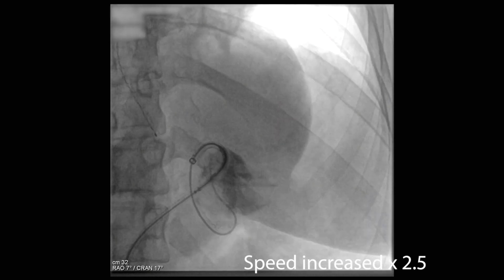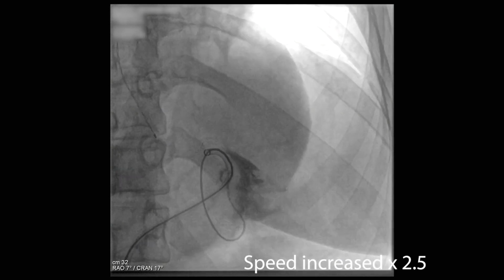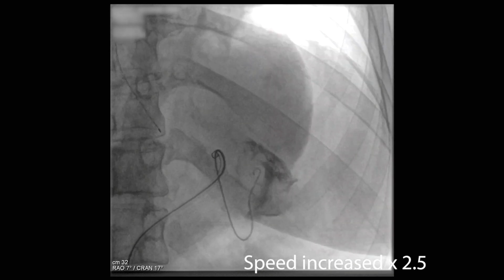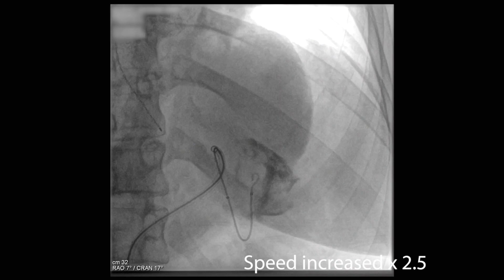Then you've got to reposition the wire distally. That involves putting the Quick-Cross back in, repositioning usually with a Glide wire, and then exchanging out for the Rosen wire again. At that point, the backup plan, of course, was to go ahead and embolize this. We did do on-table cone beam CT, and it showed that there's one main inlet and outlet branch. You'll see how we actually use fusion to mark those. This is us repositioning this. There may be a little extravasation there.